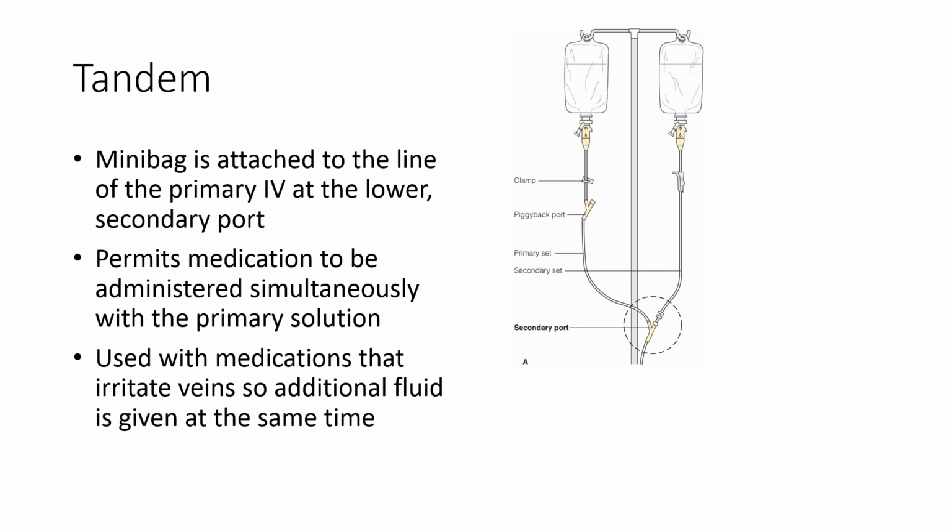As opposed to the piggyback method, where we're actually stopping that primary medication and administering the piggyback, and then it's going back to the primary. With the tandem, they're both being administered simultaneously, at the same time.